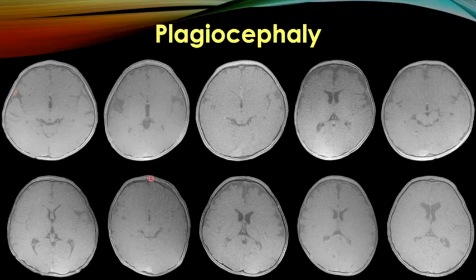So these are the normal open sutures. And so you can see that on all of these cases, we have the parallelogram appearance of the head, but all of the sutures are healthy and open. This is very reassuring. The natural history of the sutures and fontanelles is that at birth they are very wide, and this enables molding as the child passes through the birth canal. And then with progressing age, they would normally narrow, and then they would undergo fibrous closure followed by osseous bridging. That's the normal situation.